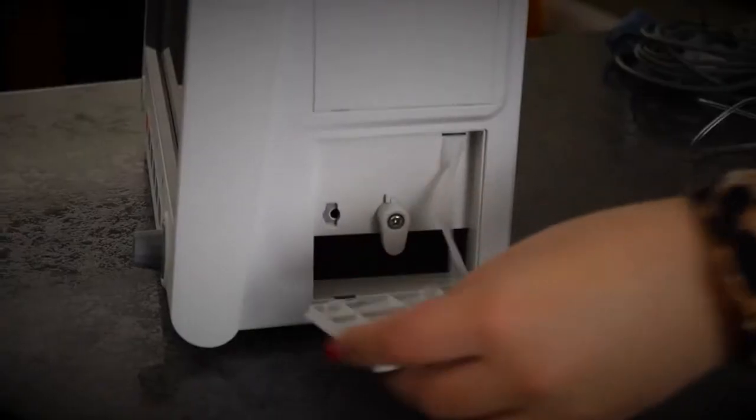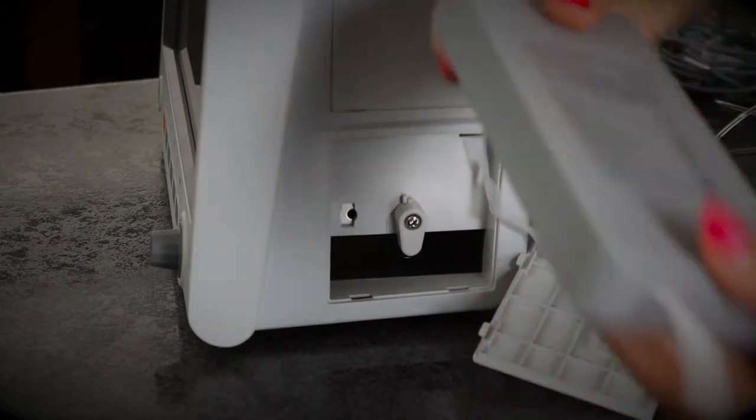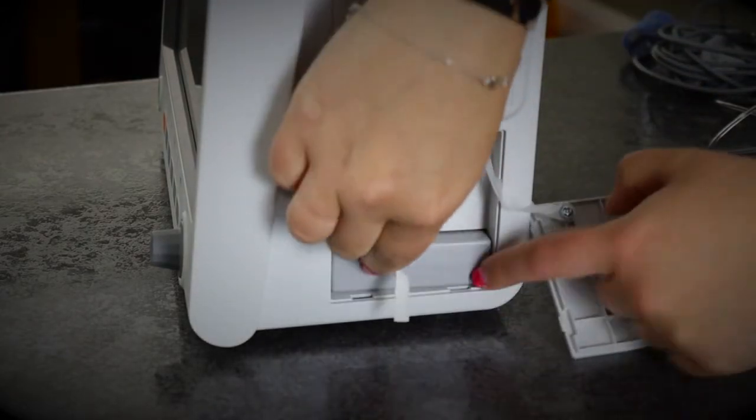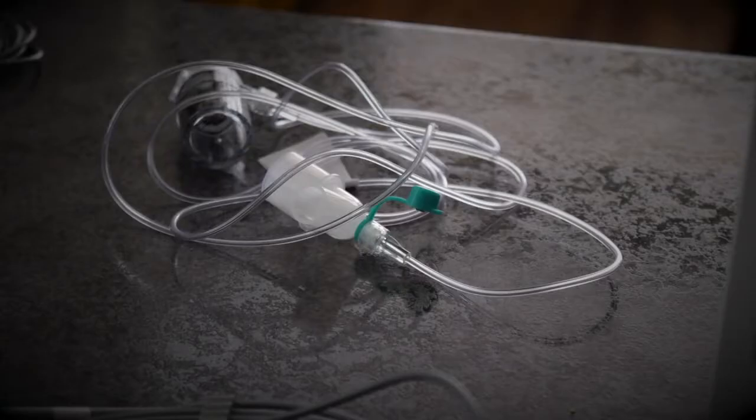I'm going to show you how to insert the battery. On the opposite side to where the wires go in, you take this out, you pop it in this way so the ribbon is at the end, you flip this to the side and you let it sit like that.